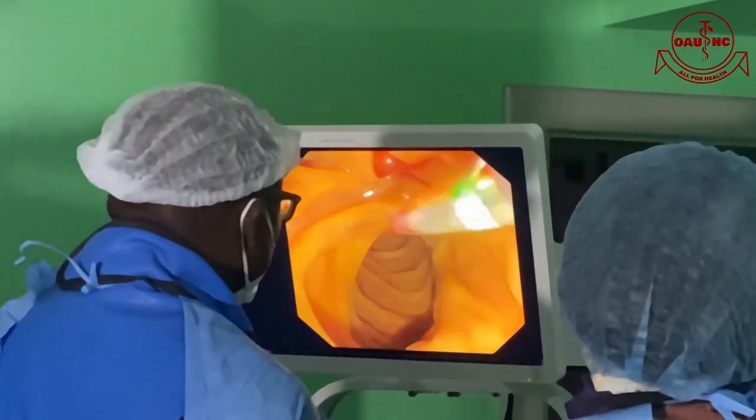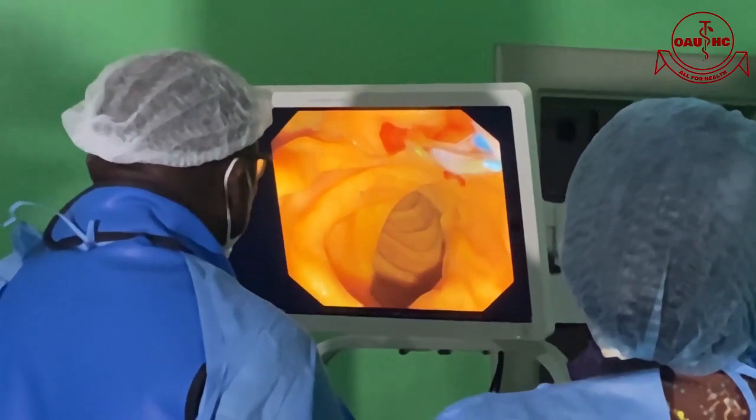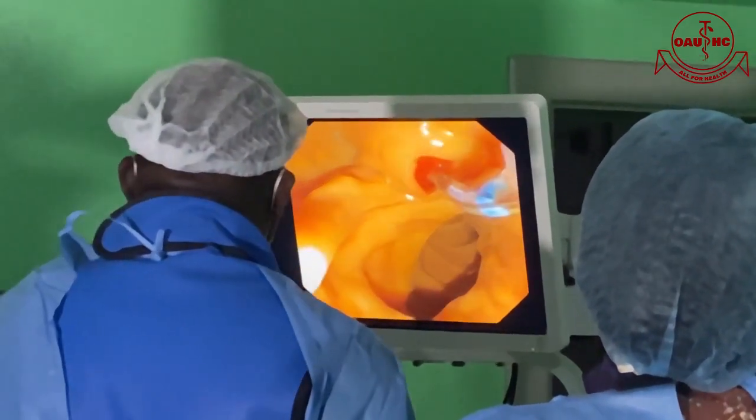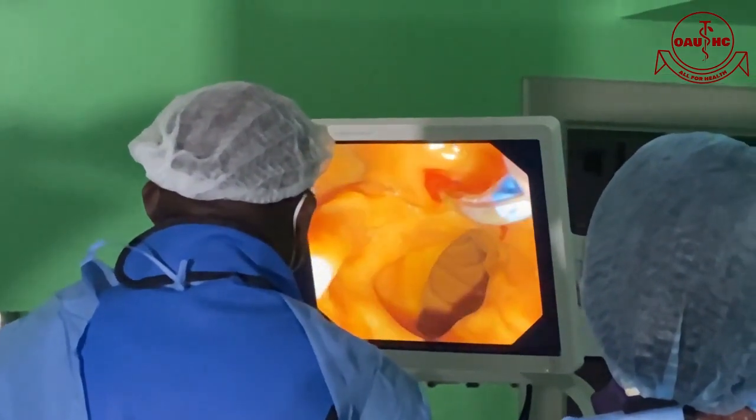ERCP is essentially called endoscopic retrograde cholangiopancreatography. It's a procedure that uses an endoscope and a fluoroscopic machine, which is essentially an X-ray machine, to visualize the biliary tree and also to treat conditions along the biliary tree.